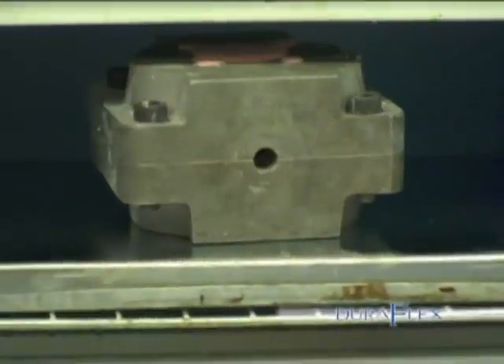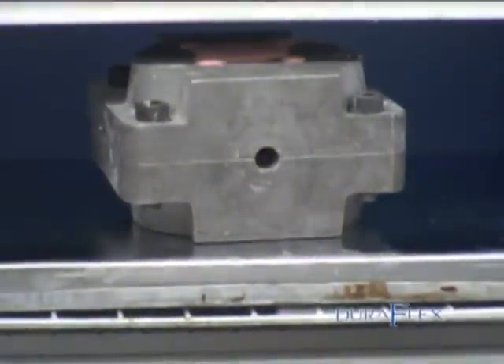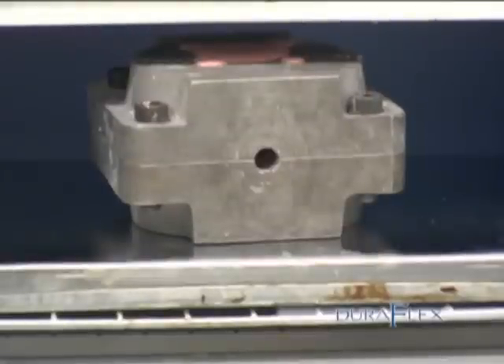Heat up flask. While holes were being placed in the teeth, the flask would have cooled down, so the flask needs to be heated up. Set the flask in the oven at 250 to 300 degrees Fahrenheit and preheat the flask for 15 minutes.